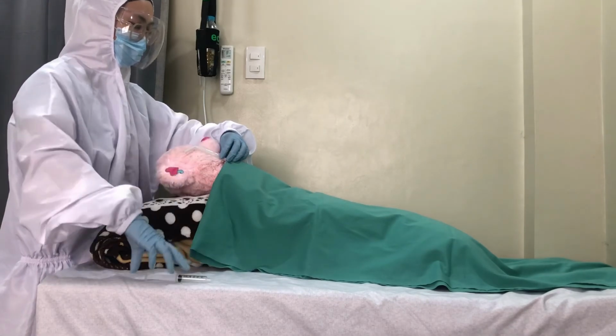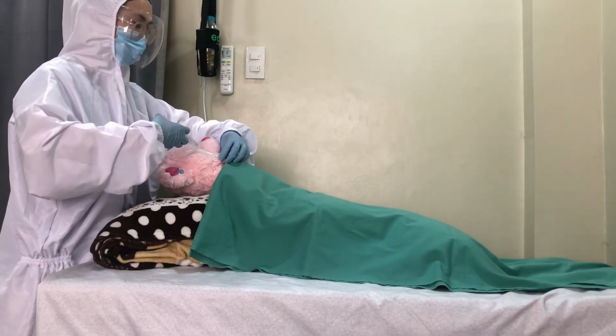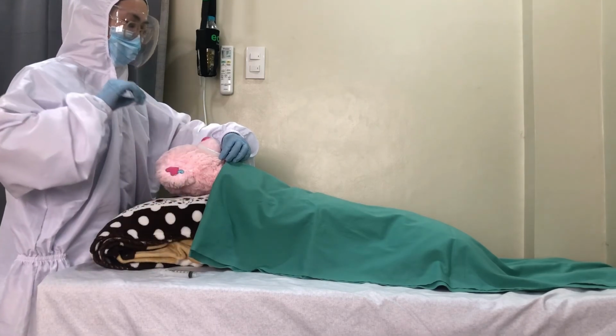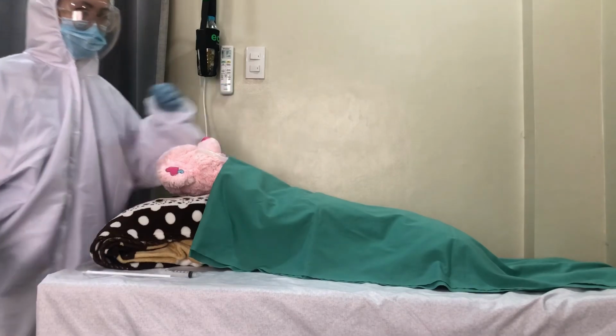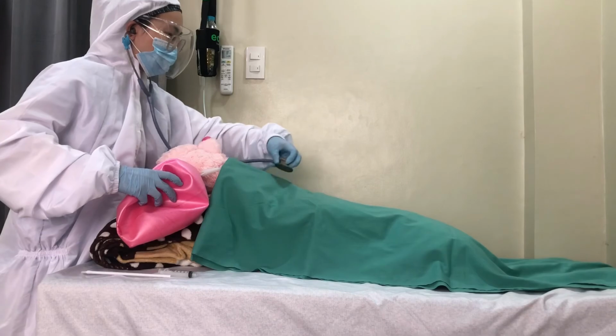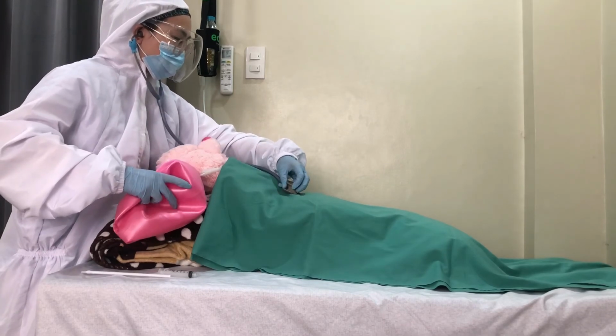While holding the endotracheal tube in place, inflate the cuff with an empty syringe and pull out the stylet from the endotracheal tube. Connect the tube to a bag and confirm correct placement by using the 5-point auscultation method.